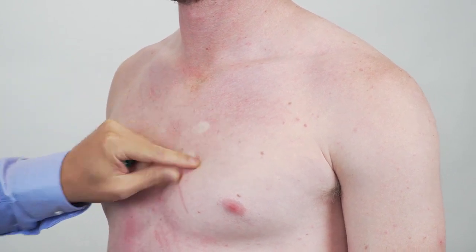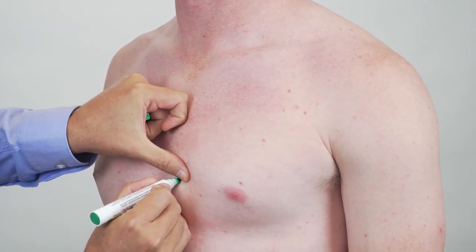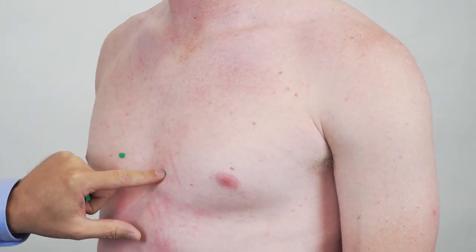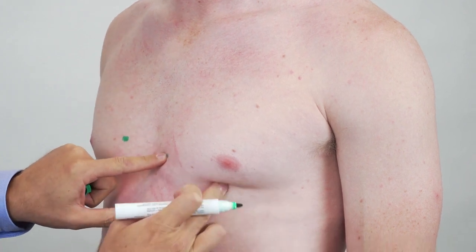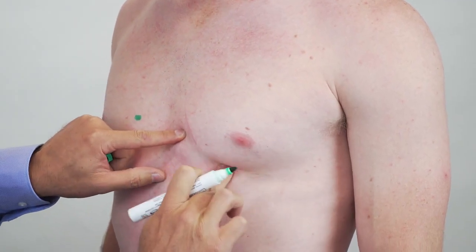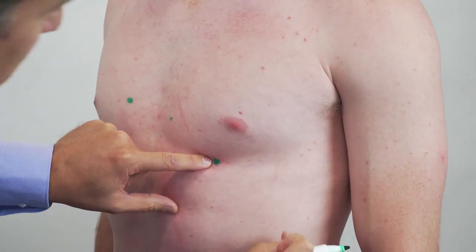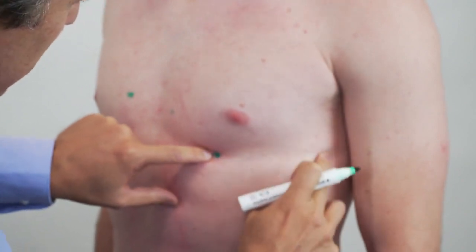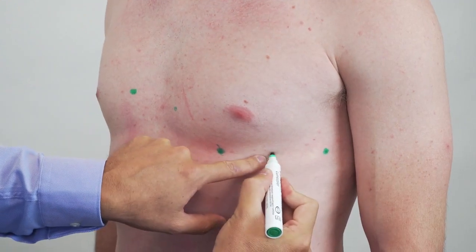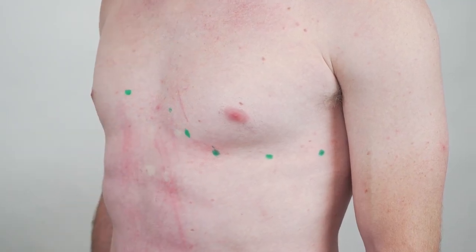Then I have to move two down to get the fourth intercostal space, and that will be V2. V1 is just opposite that on the other side. Next I will find V4, which is mid-clavicle and just one intercostal space lower. Then I'll look for V6, which is mid-axillary on the same level. Halfway between these two is going to be V3.